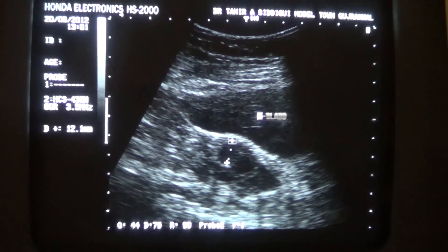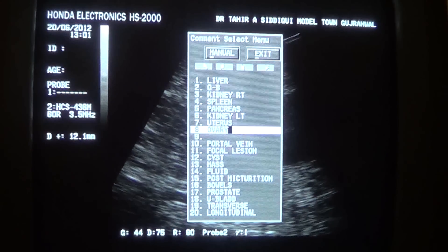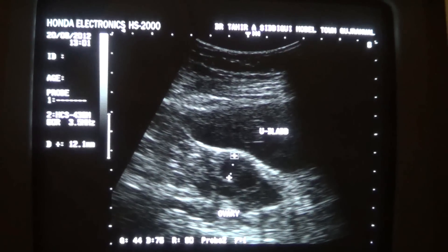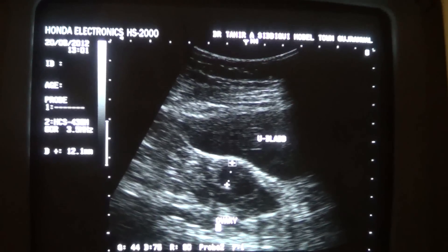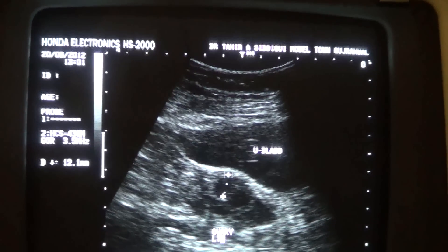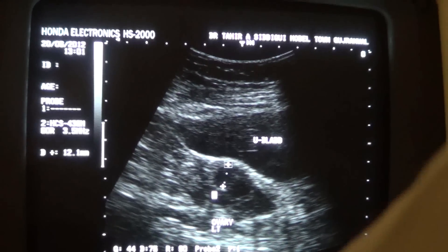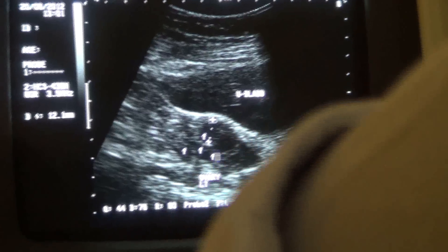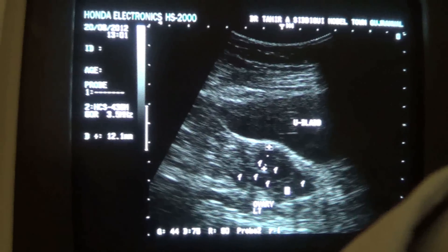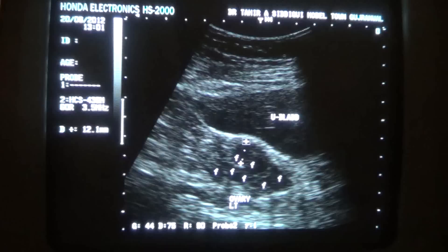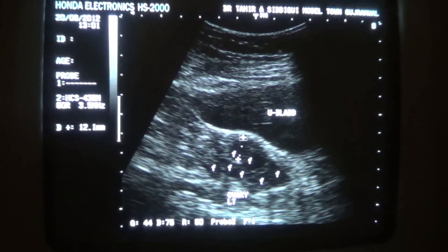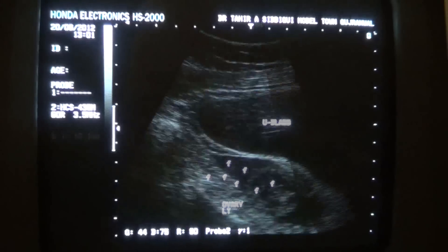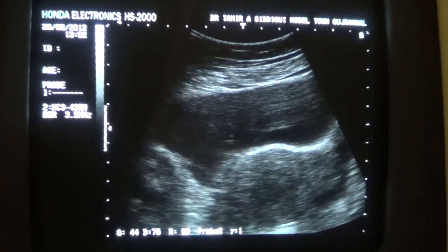This is the urinary bladder. This is the ovary — the left ovary. And these are the follicles. This is the consequence of hormonal excess.